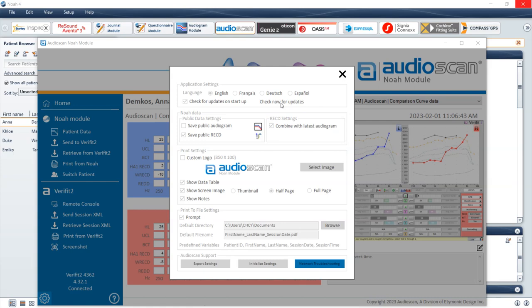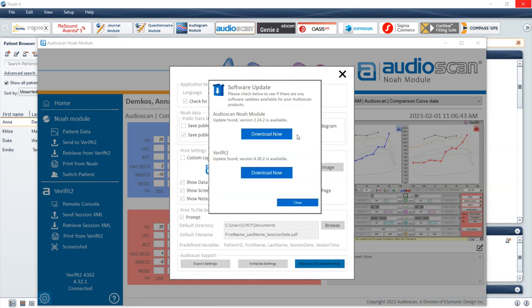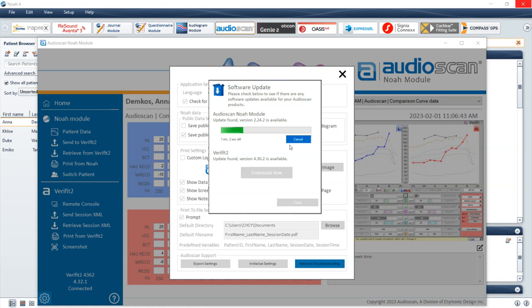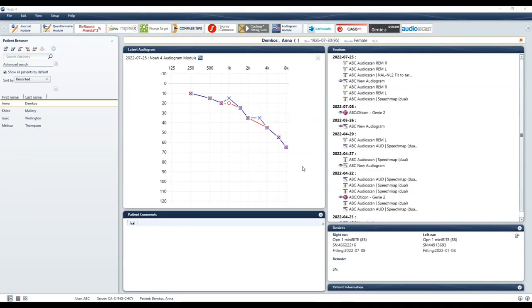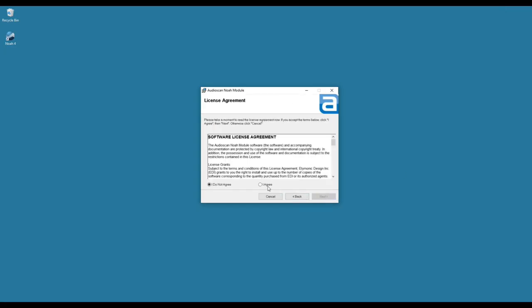Selecting Check Now for Updates manually checks for the latest software on the AudioScan website and compares this to your currently installed software versions. If new software is available for the AudioScan NOAA module and VeriFit2 or Axiom, a Download Now button will appear. Select Download Now to download the latest software update. Once the software is downloaded, you will be prompted to install the software update.